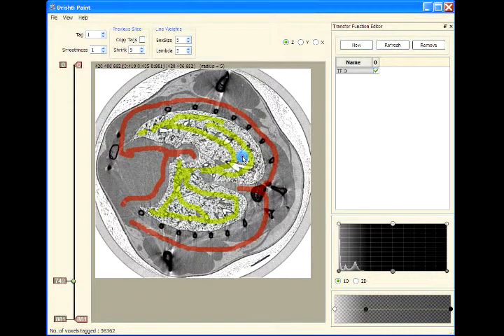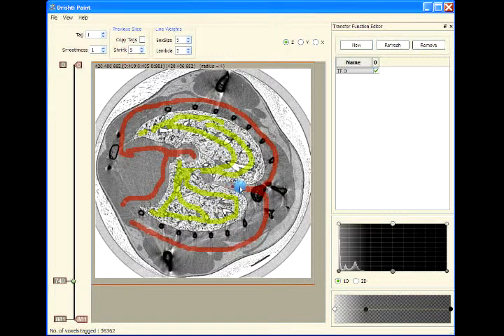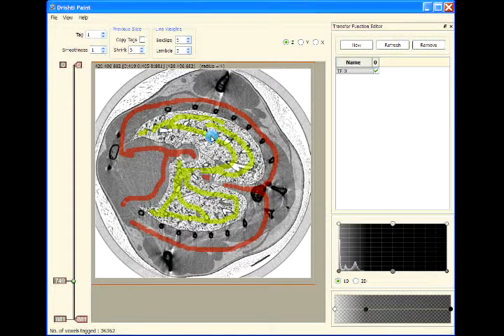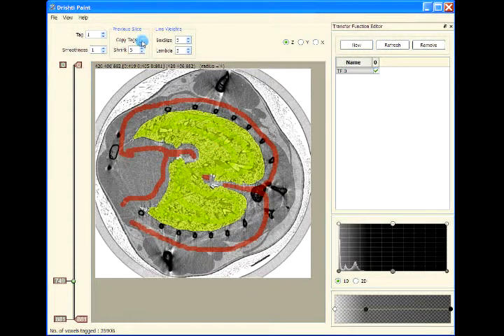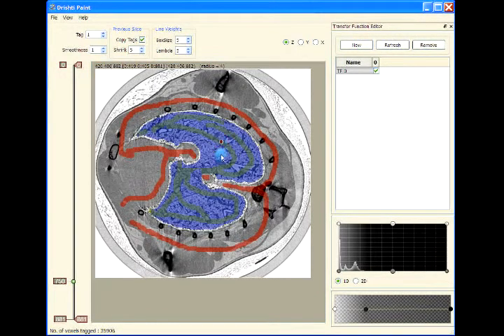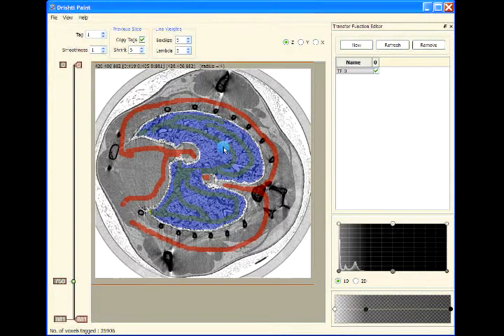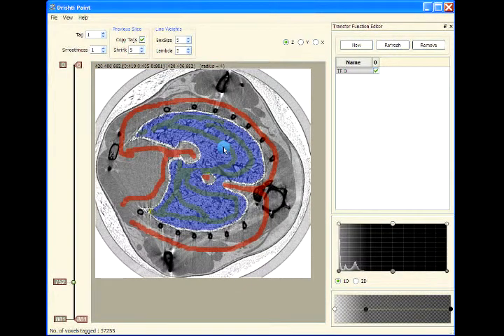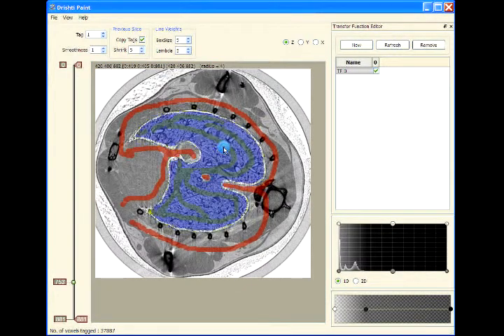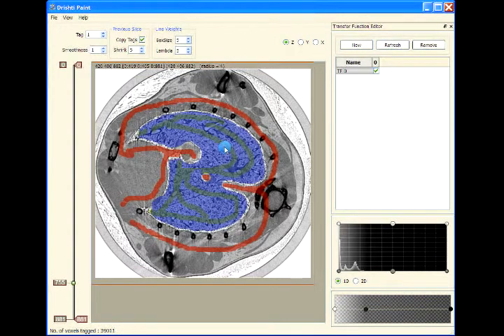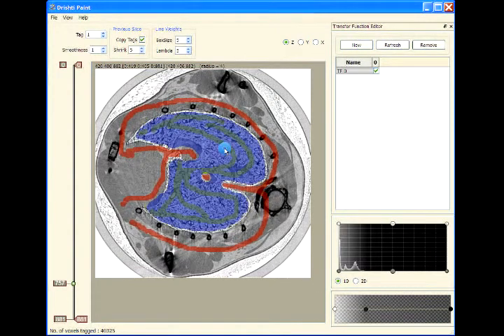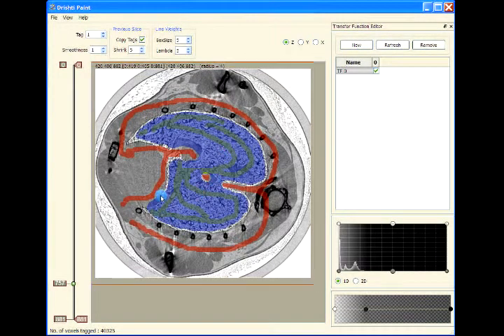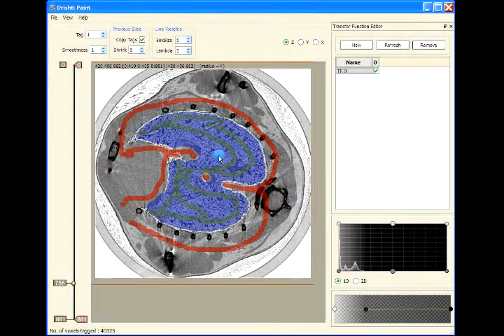Then we go on to the next one and press tag. Now if we copy the previous tags it might also work. You can do it for this section of the data but it starts leaking here so we have to be careful.